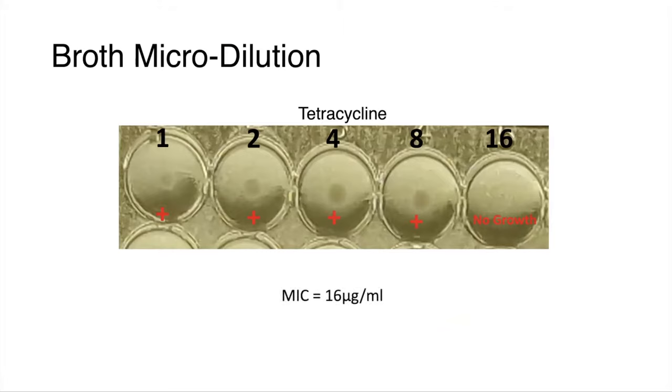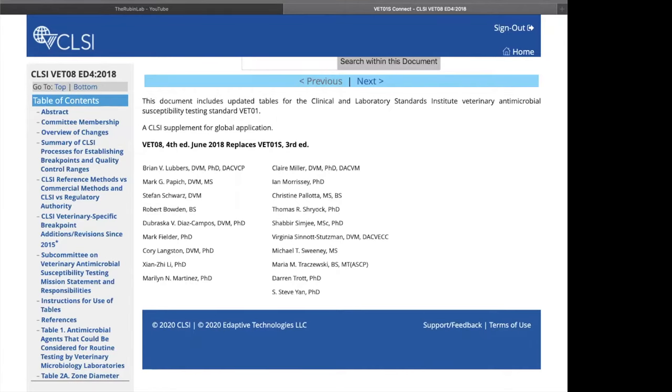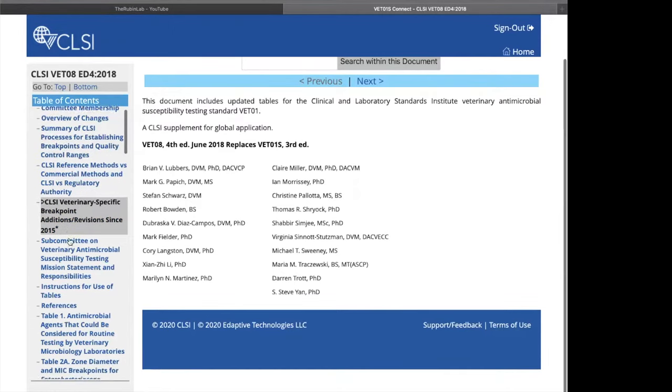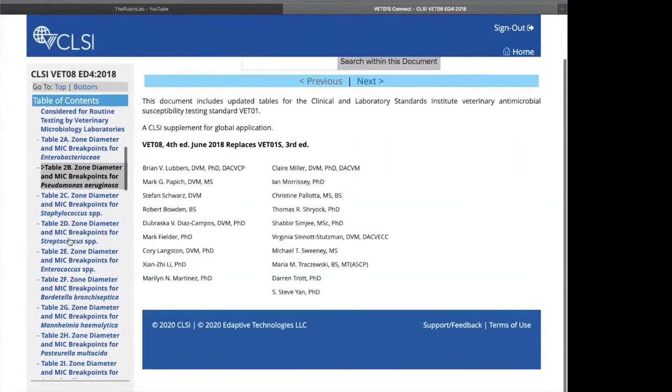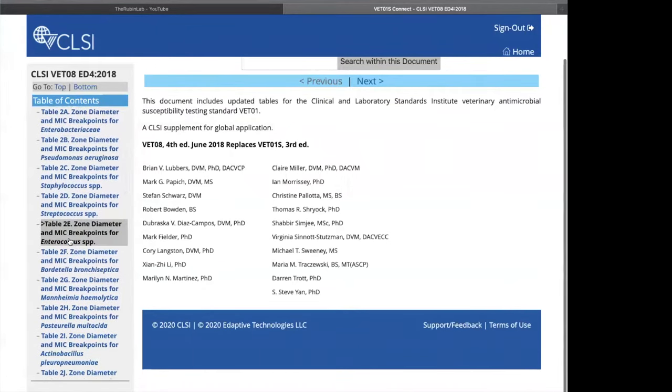These results can then be manually interpreted by comparison with the CLSI guidelines. This is the online version of the CLSI guidelines where we find our interpretive criteria for susceptibility tests, and as you can see over here on the left, we have all of the different organisms we might be interested in listed. This is where we'll find each of our sets of breakpoints.